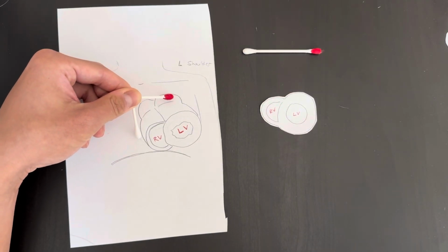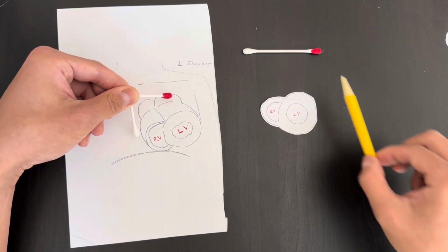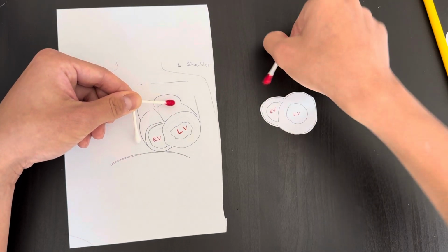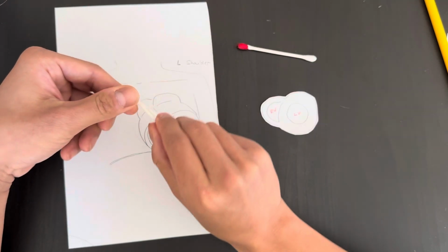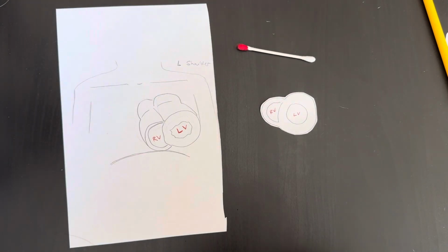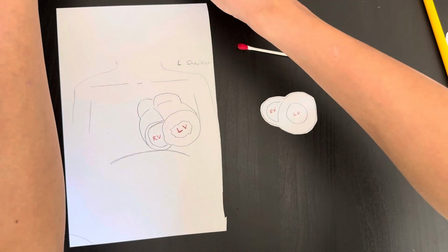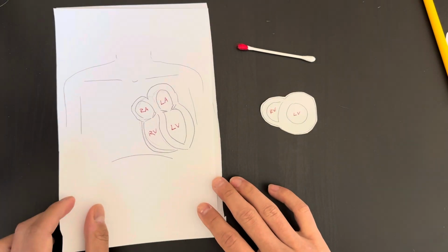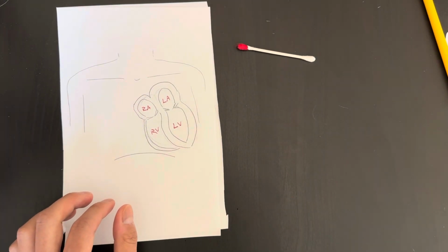We're all saying the same thing here. This is the final product. This is how you get it if you're in cardiology mode. And if you're in a traditional radiology POCUS mode, you just flip backwards. All right? Now, let's get a little more complicated. Let's say now I want an apical 4-chamber view.